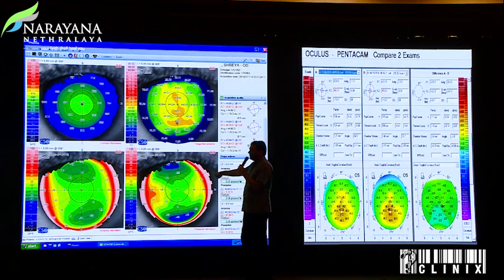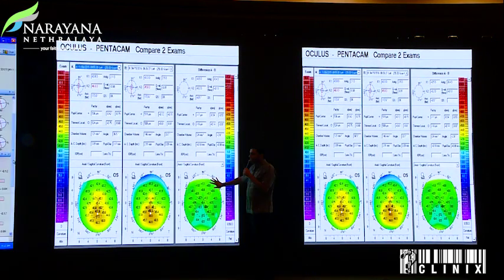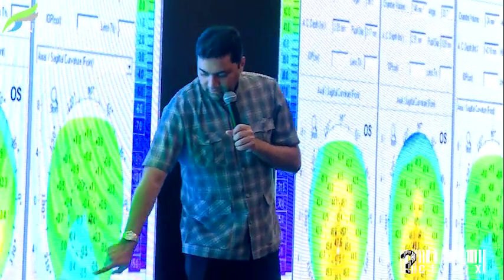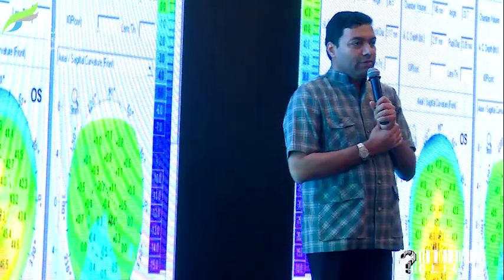You can't get it here? Okay, doesn't matter. See, fantastic, because this is very important. It's a good map, and thankfully they got it. So let's assume this is a progression map, and you see that this area is 0.4, 0.5, kind of bordering your repeatability range.